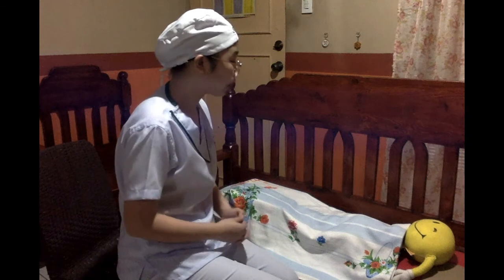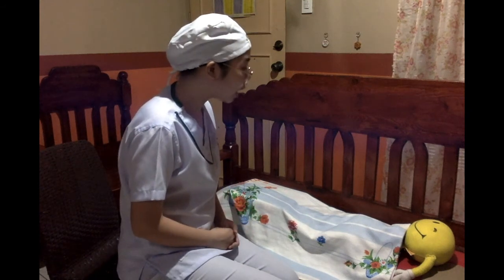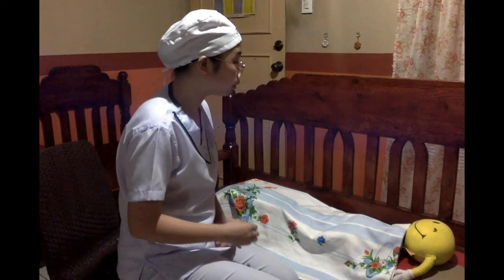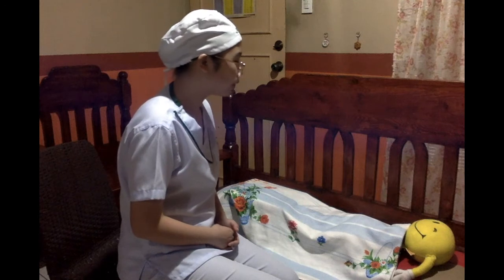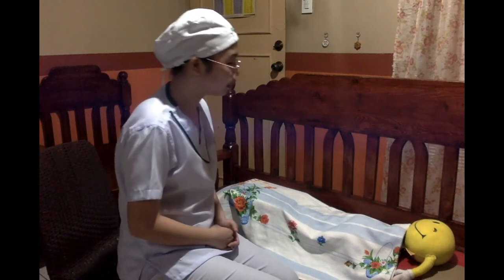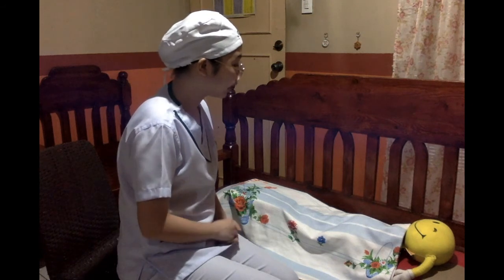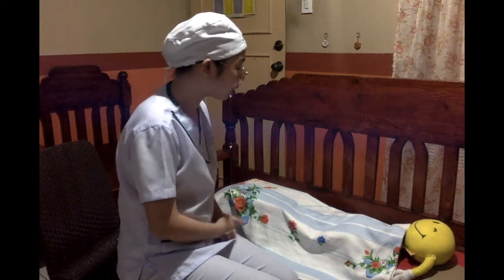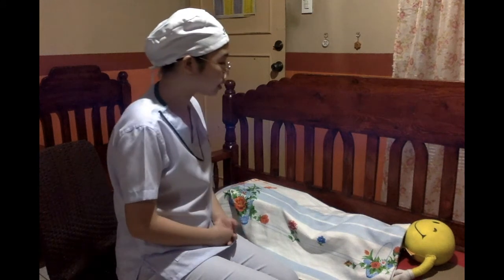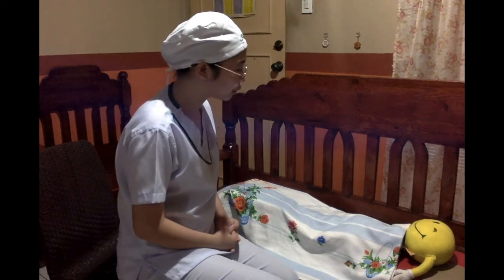And ayun po, yung catheter po na ipapasok po natin o yung manipis po na tubo po na yun, makakatulong po sa inyo para po mailabas nyo yung ihi po na naimbak po sa loob. Opo, hindi po kasi pwedeng magtagal ng ganong katagal talaga yung ihi sa loob. Kasi, di ba po, ang ihi, yan po yung mga dumi na rin natin sa katawan na kailangan talagang ilabas. Opo. May mga tanong po ba kayo?